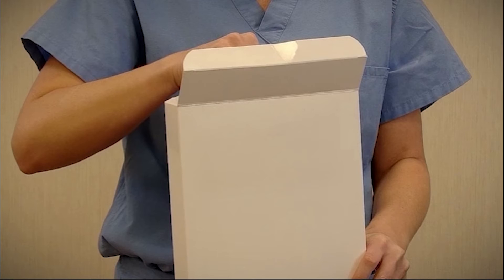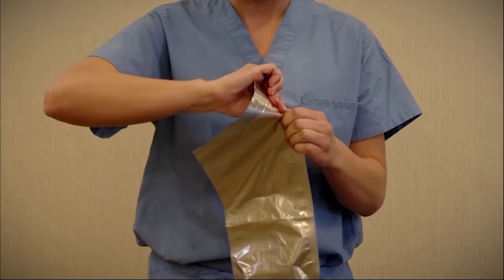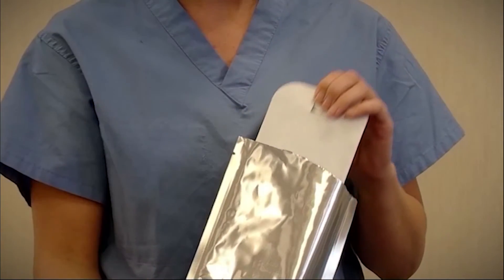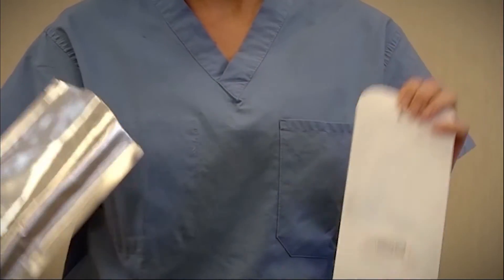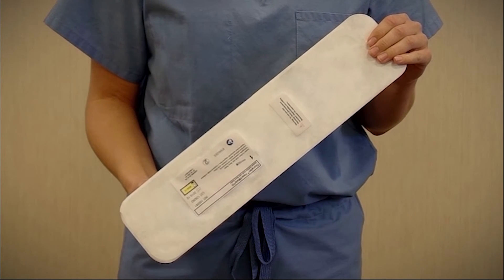To prepare a sealed outflow graft for implantation, first open the box and remove the foil pouch. Then open the foil pouch and remove the non-sterile outer tray from the pouch. Do not introduce this tray into the sterile field.